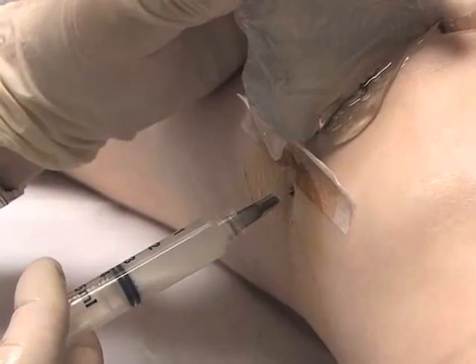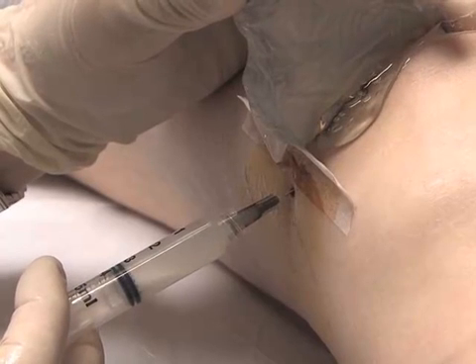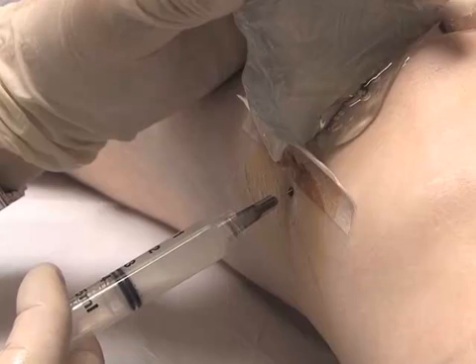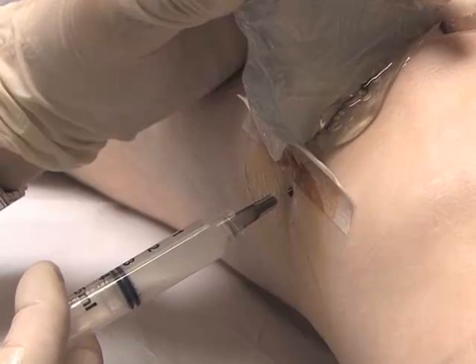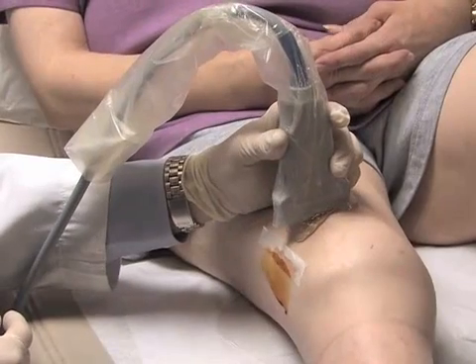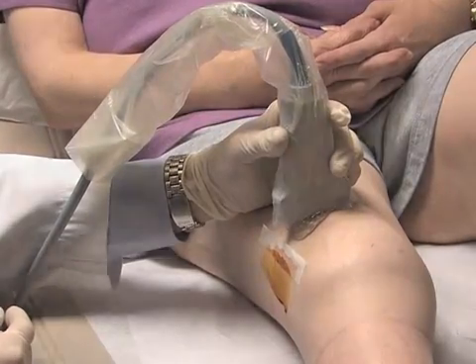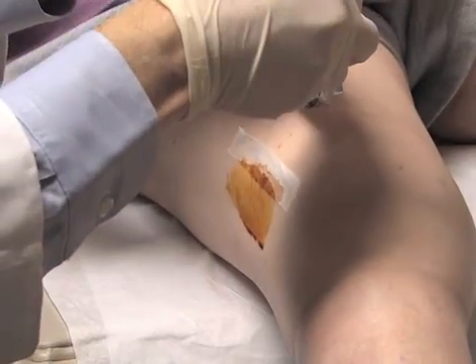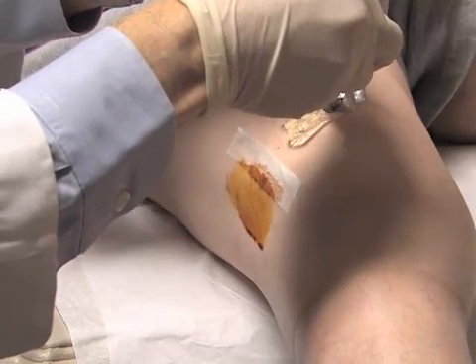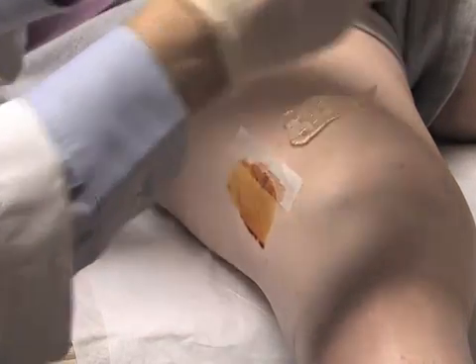Injection of the knee may be performed via several approaches. In the suprapatellar approach, the needle is inserted just posterior to the superior edge of the patella. The procedure is often performed with a sterile probe sheath and drape. Alternatively, some experts have developed a method using tape as a barrier between the injection site and the ultrasound probe and non-sterile gel.